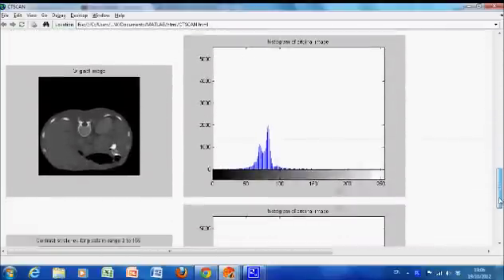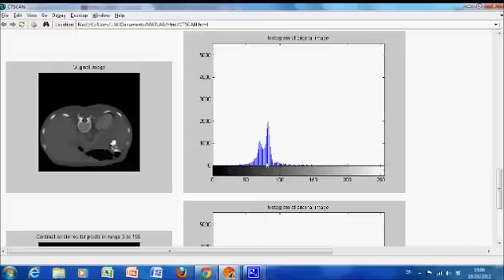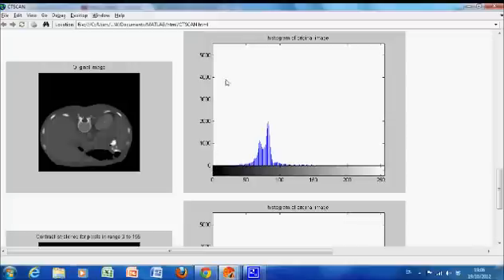The problem is today we have this CT scan here, and I do the histogram here on the right. It's rather hard to see when you look at it on screen, but there is a lot of black we can see here. Just as I run the mouse up and down the Y axis, there's way over 5000 black pixels.